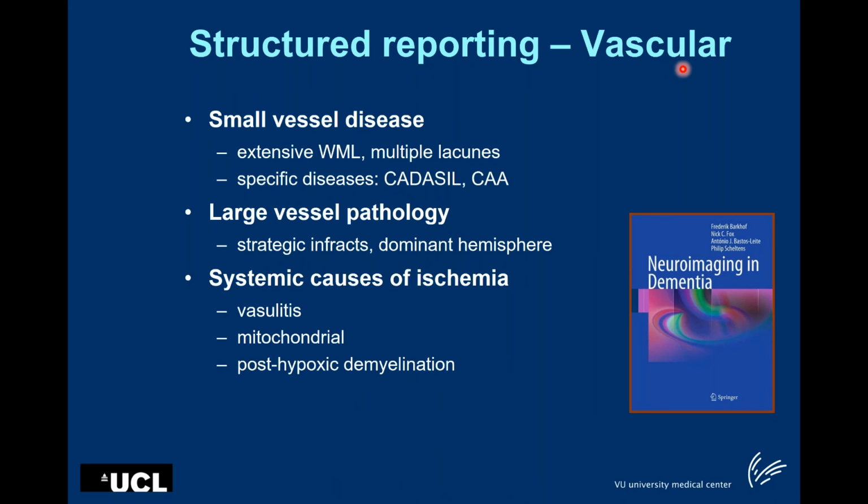We talked about, remember, exclusion of a mass lesion, looking at swelling. Then we need to look at bright signals on the FLAIR. So there's the CJD in the cortex, there's the primary white matter disease, and then there's the vascular pathology. The vascular pathology can manifest in many ways.